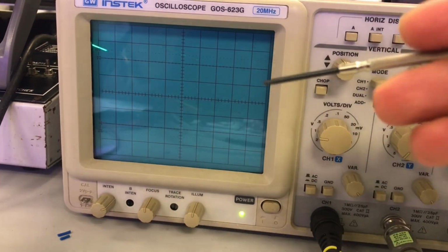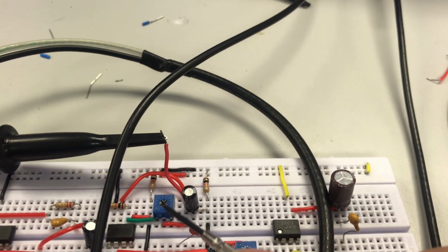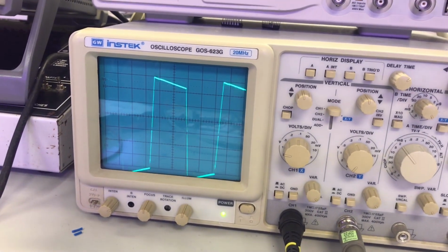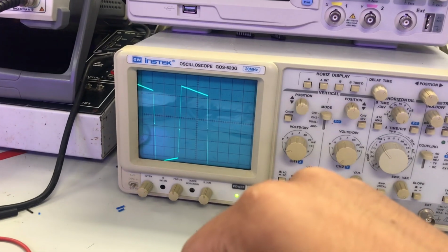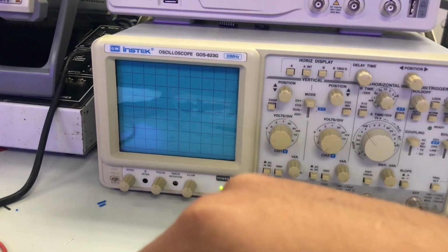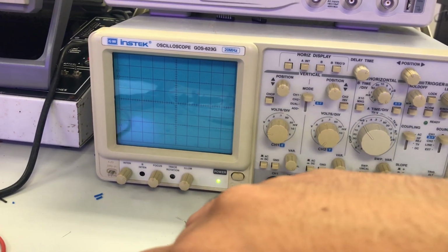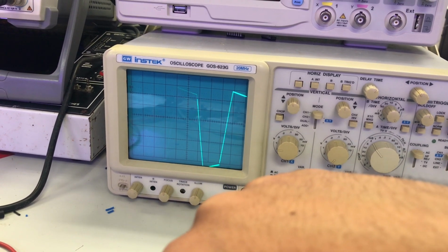So this is my waveform now. Since I connected my circuit to this trimmer, I'll be testing out the trimmer to see if there'll be any changes on the graph. So let's go clockwise. No changes. Okay, I'm going anti-clockwise now. When I've turned it completely anti-clockwise, there are no graphs here. When I open it little by little, I can see the graph again.